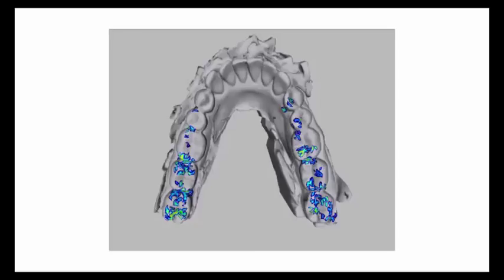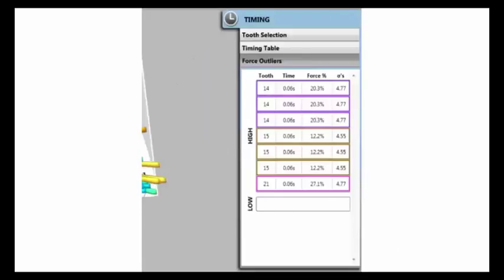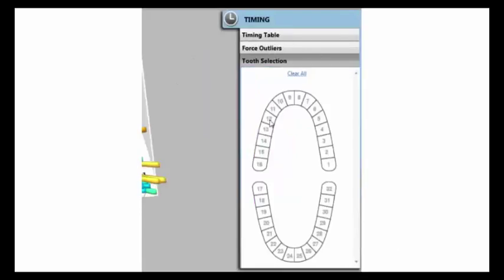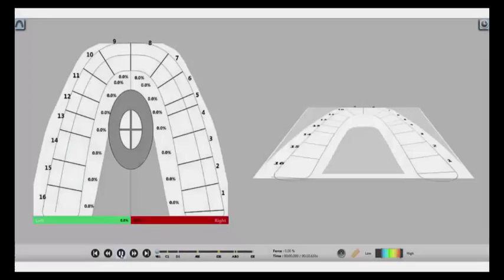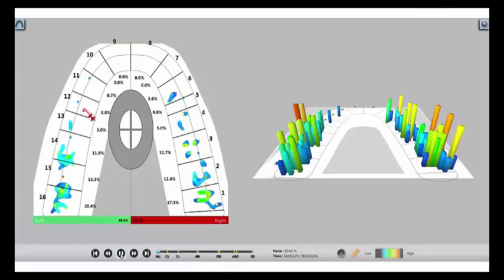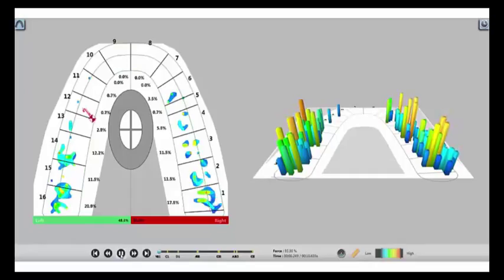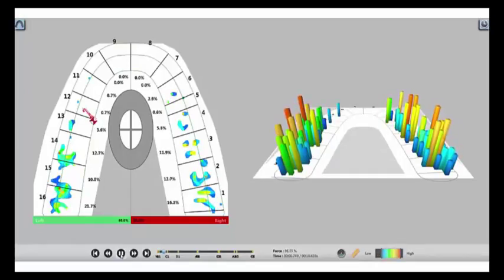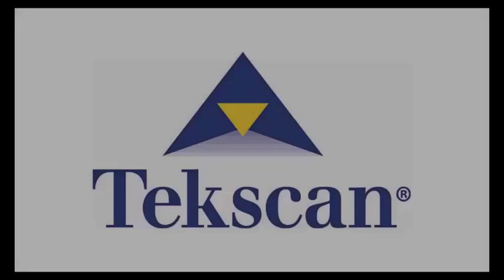Other software features give you the ability to see forces on individual teeth as well as timing. It's a revolution in occlusal analysis to help improve patient education and treatment outcomes. It's occlusion data like you've never seen before. It's T-Scan 9.0.